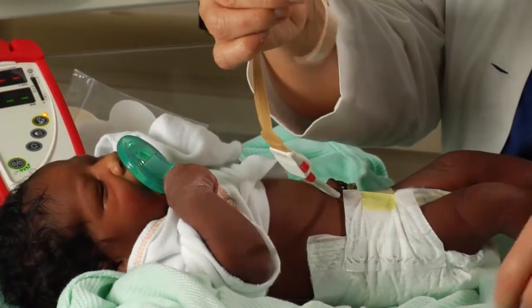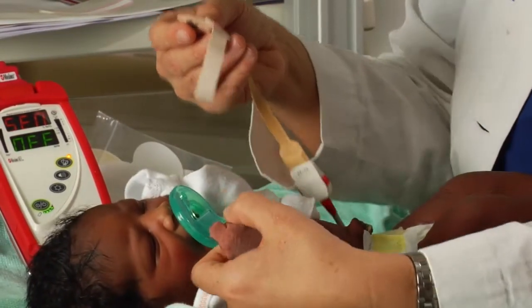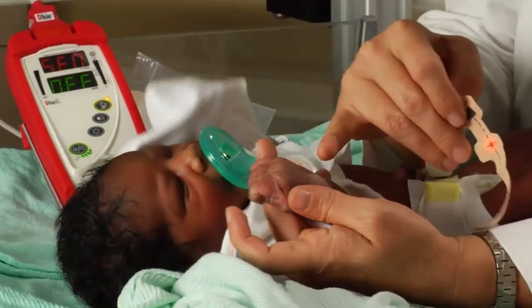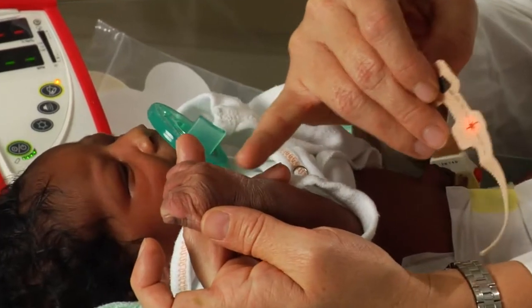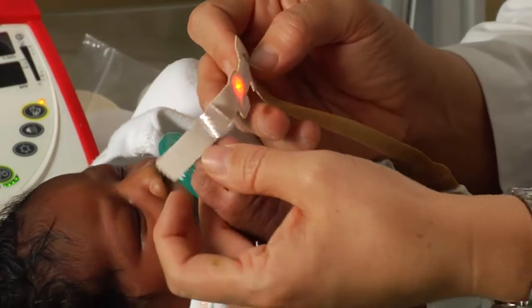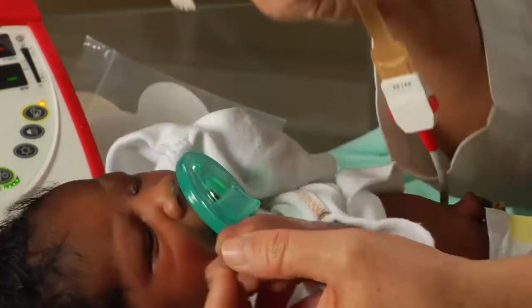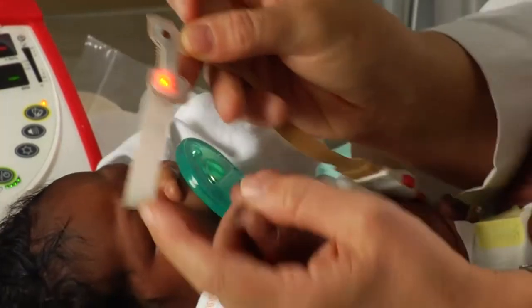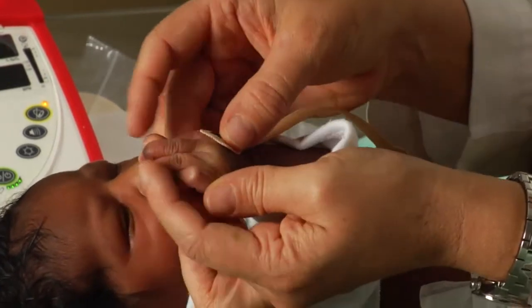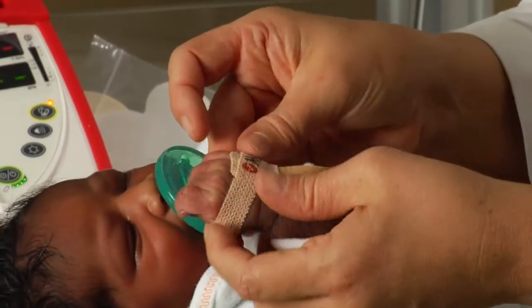Then it's as easy as taking the adhesive off the back and attaching it to the baby. So with a baby's hand, they're fortunately small enough that the easiest places to place the probe are on the outside of the hand or on the wrist. The manufacturer guidelines say you can also use a finger, but baby fingers are so little that that can be difficult to do. An important part is to make sure that the red light is placed opposite the sensor on the baby's hand. And then you can just use the tape to wrap that around.